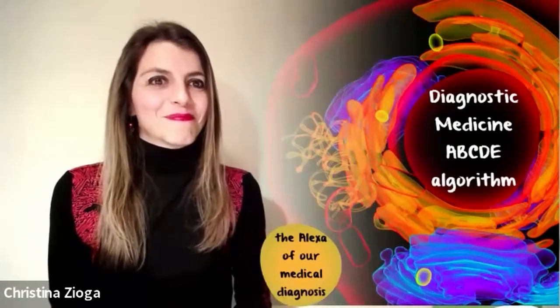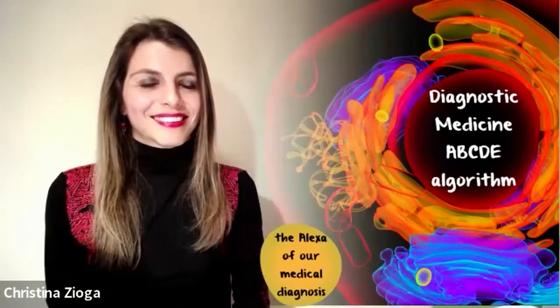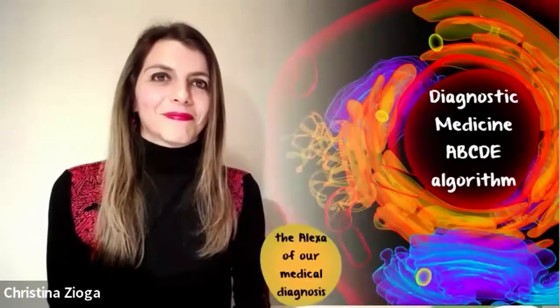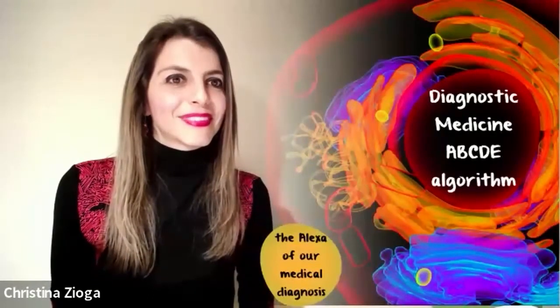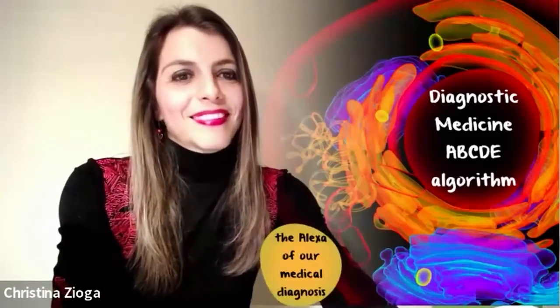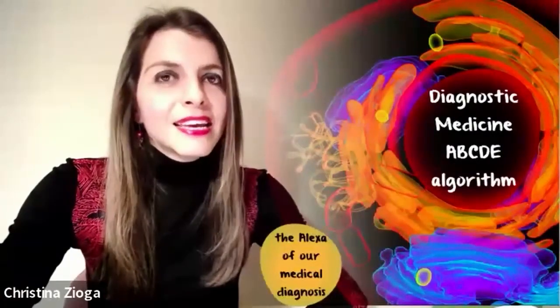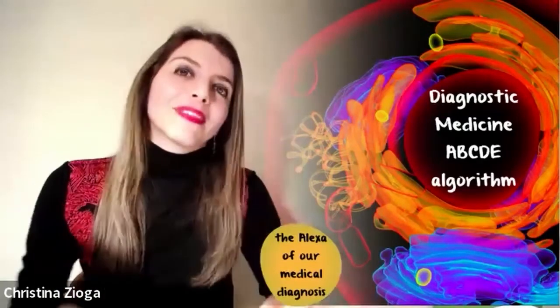How can we not forget to check the A of your algorithm? I mean, how can we not forget to control the demographics and also the correspondence between the slides we have on our microscope and the slides that were prepared? Because this is something that we usually forget to do. Because sometimes we just go to the diagnosis and we forget to check the labels and so on.